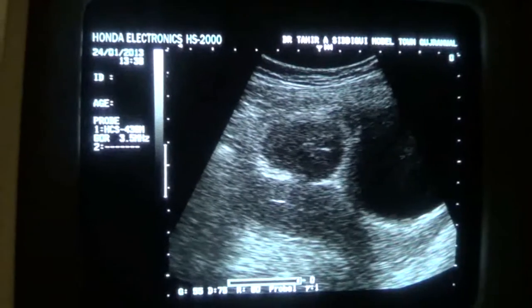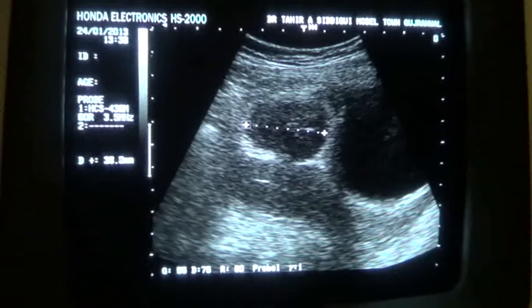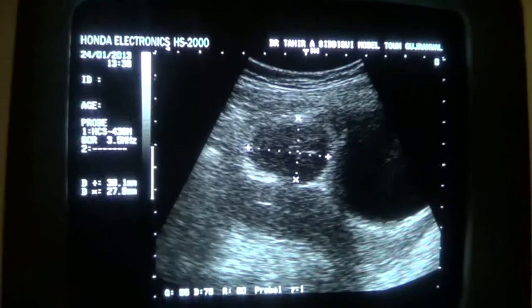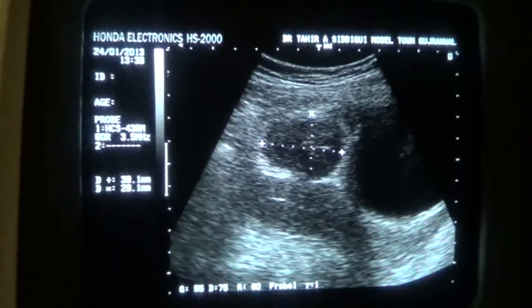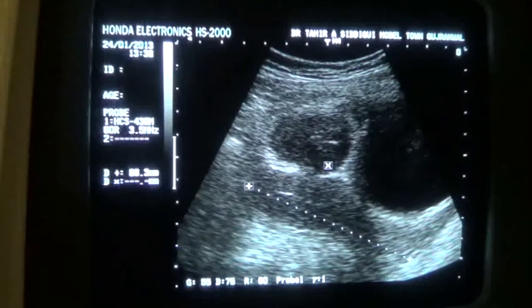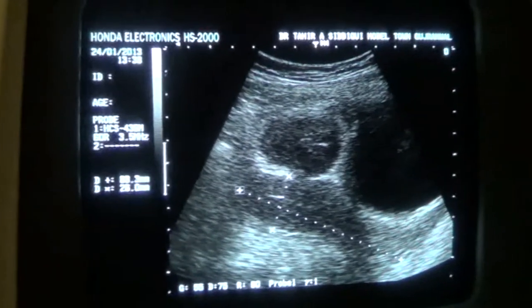within the endometrial canal, because in itself this is the endometrial canal, and this collection measures approximately 4 by 3 centimeters, whereas uterus measures in longitudinal section 8.8 centimeter by 2.6 centimeter, which is anyway within normal dimensions.